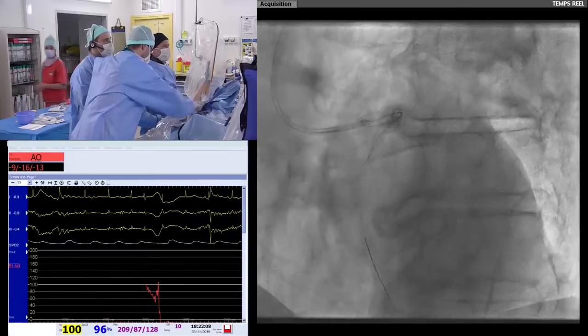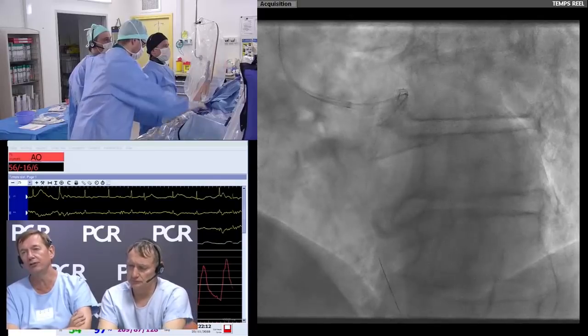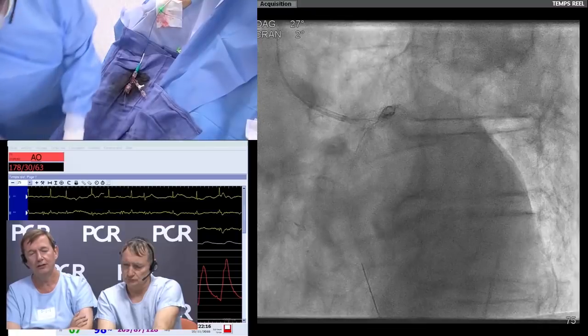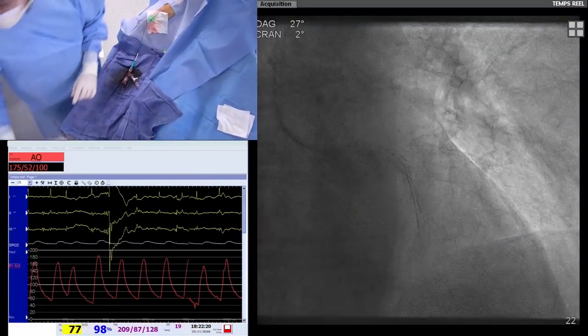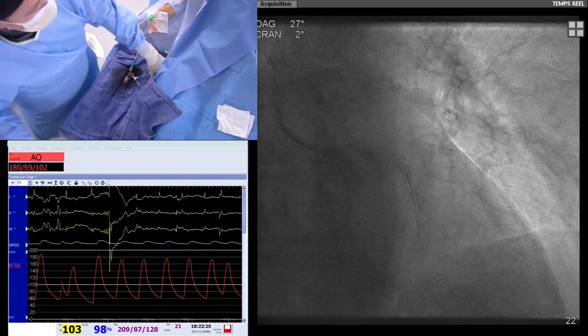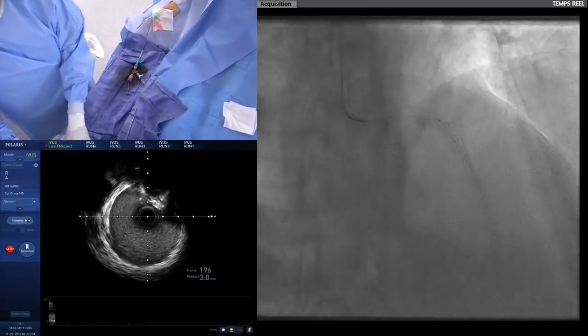The questions have changed to comments now about what a perfect case you've done here, Nicolas. So. I think so. I am in the left main. You can see the IVUS. I start the pullback. We can switch to IVUS, perhaps. Big screen. I have a small screen angio.